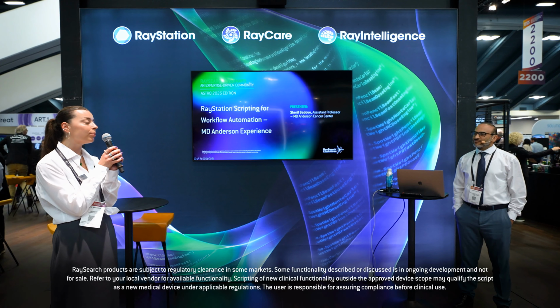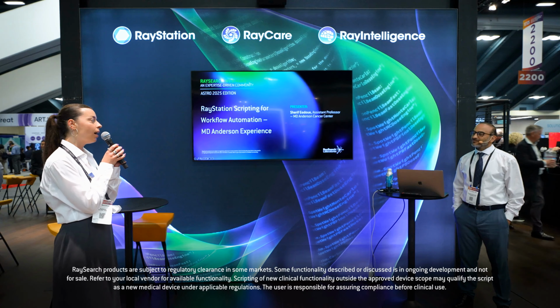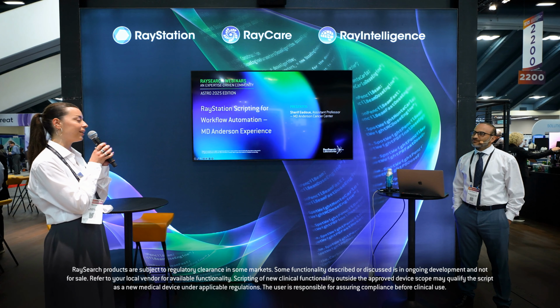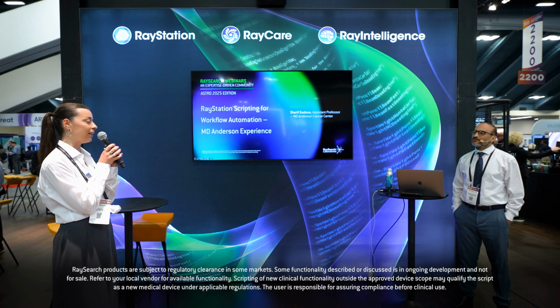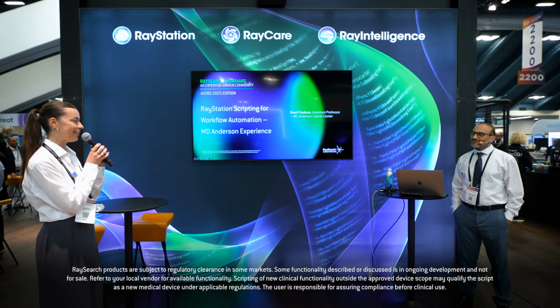I think it's extremely important to see how automation can benefit clinics. And we will see that today with your talk, since you will be giving your expertise and knowledge within scripting and automation workflows. So please go ahead.